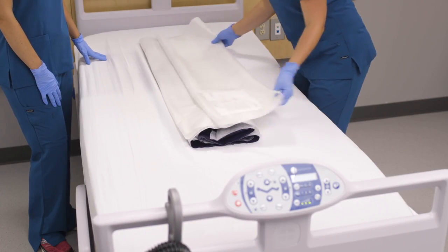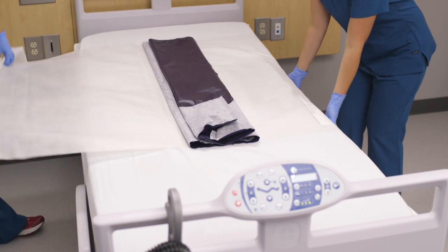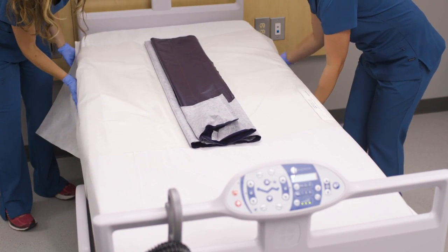If possible, place the Q2 Roller on the bed prior to receiving the patient, or place it underneath the patient using a log rolling technique. Tuck the securing apron flaps under each side of the mattress to keep the Q2 Roller in place.